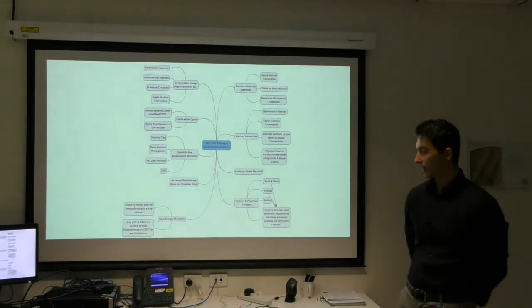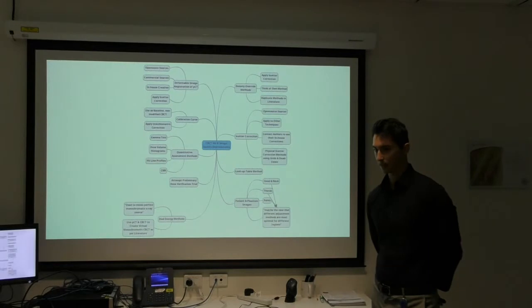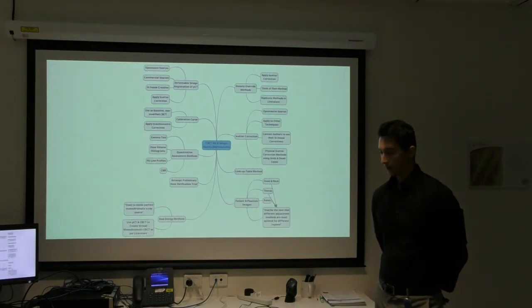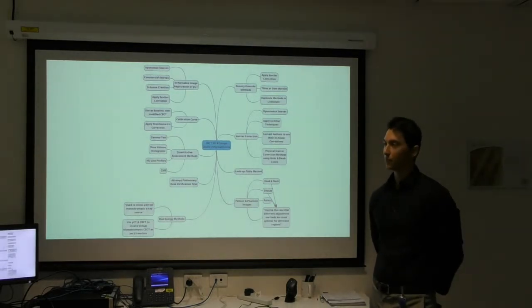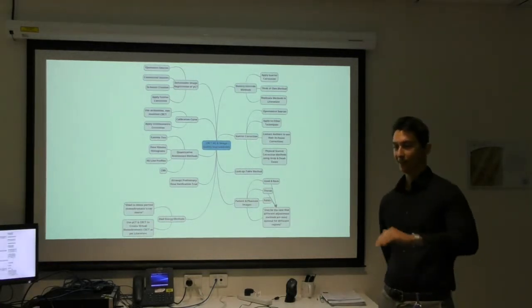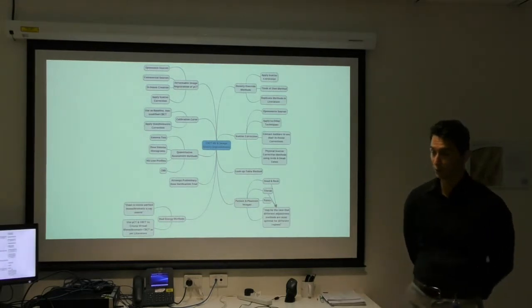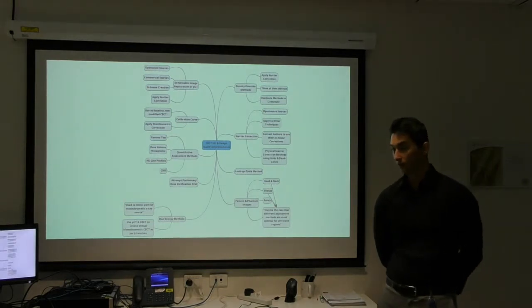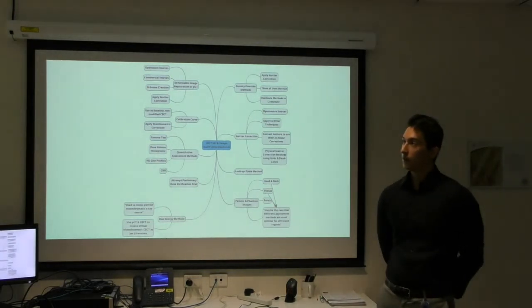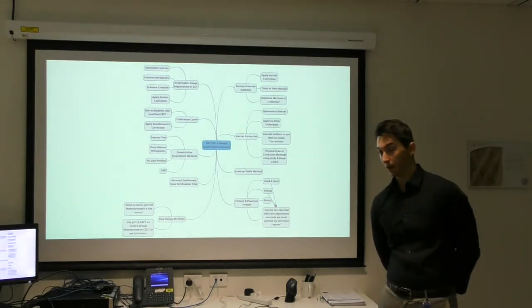But the thorax actually presents one of the largest issues with CBCT acquisitions because they take so long. They take something like a minute, and there's no way you can actually properly. It's not like a normal CT, where a normal CT, for example, can match, I think, the phase of the breathing and then correct that. CBCTs don't have that, so that would be an interesting way to improve the image quality in the reconstruction phase. You can take image sets from when the lungs are at the same phase, and then that would eliminate motion artifacts.